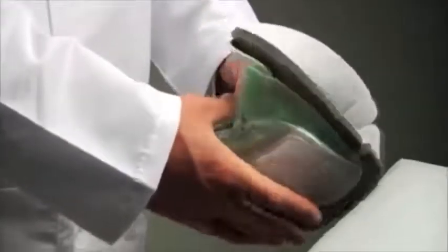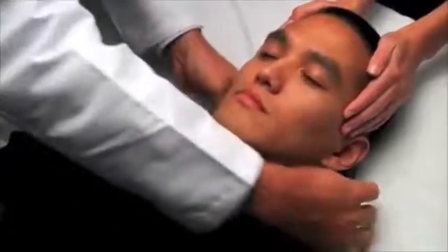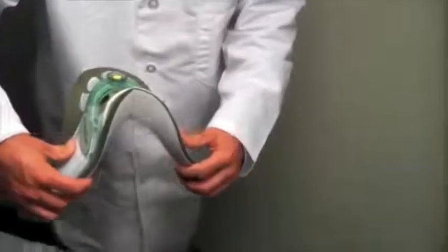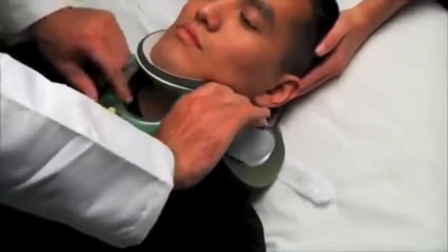Preform the back ends of the side panels by squeezing them until they are slightly curved. With the head in neutral alignment, slide the back panel down and under the patient's neck. While pulling the sides of the front panel apart, position the chin piece so it touches the patient's chin.